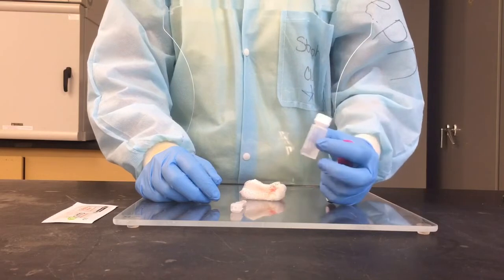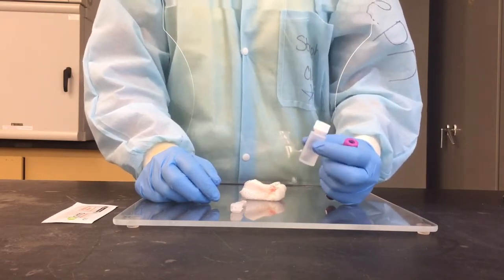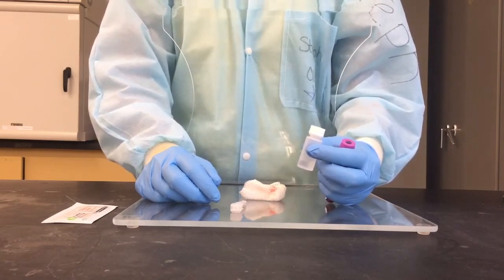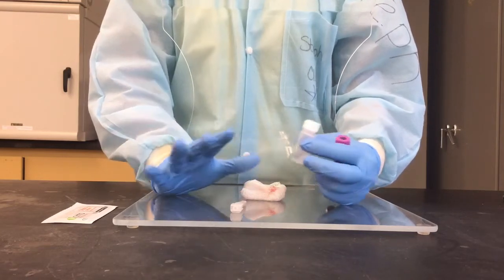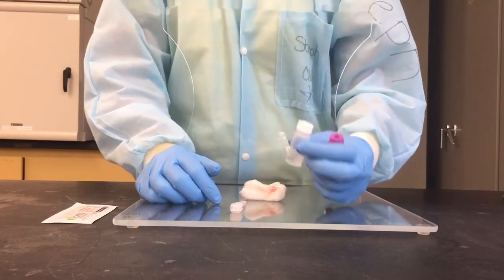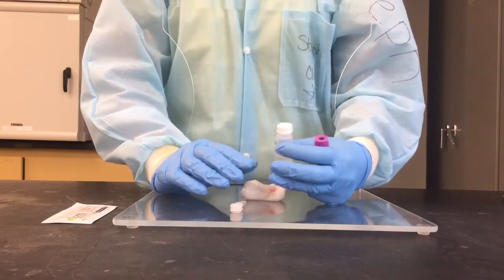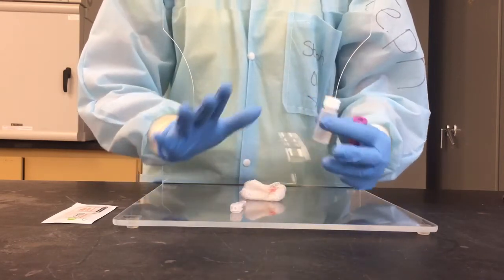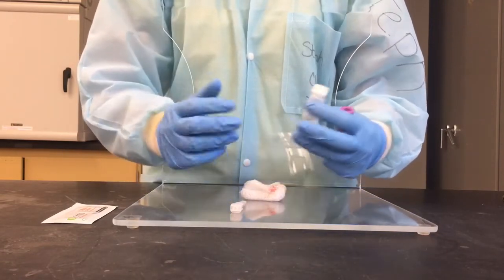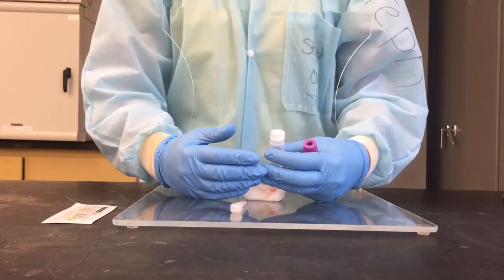Inside this reservoir is ammonium oxalate, which acts as the diluent for this procedure, and the function of ammonium oxalate is to lyse all of the red blood cells that are in your suspension so that you can more easily view the white blood cells. You can use this for platelet counts as well, even though we won't do that. The purpose behind lysing all of the red cells is because the red cells are the most numerous cells in your blood. And so you have lots and lots of red cells, and if you're trying to count only the least numerous cells, your white cells, it's really challenging to do that with all these red cells sort of in the background and in your way.